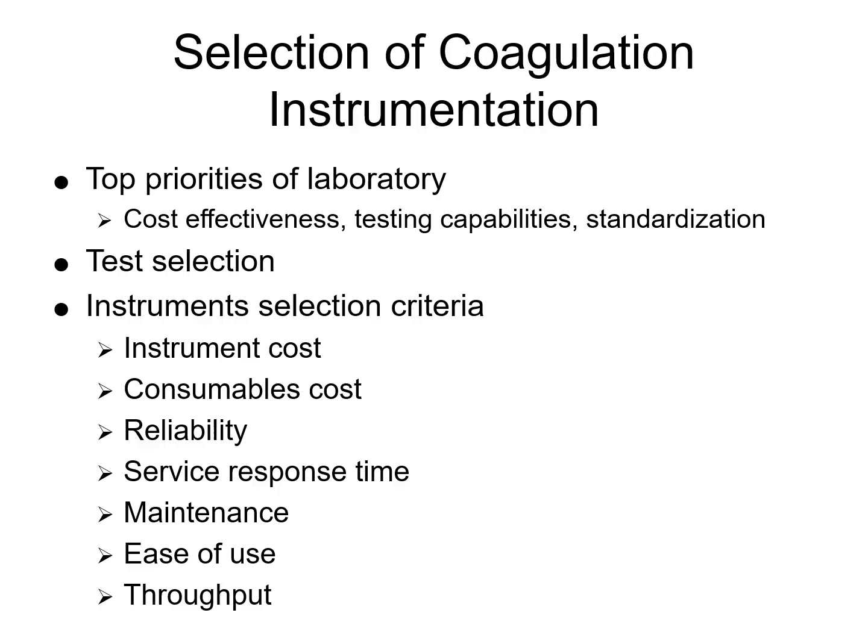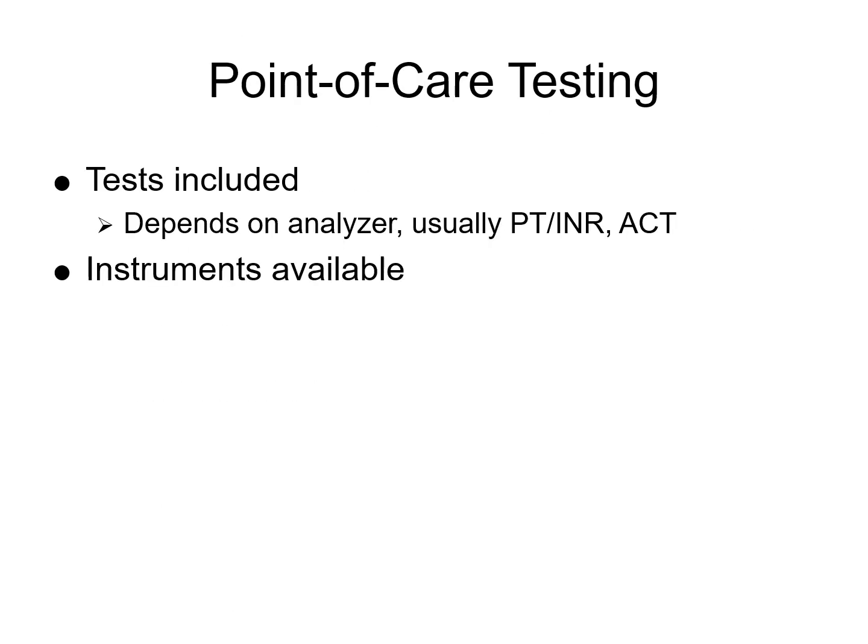Maintenance, so requirements for routine upkeep and ease of performing maintenance tasks. We want it to be easy to use. We want it to be user-friendly. We want it to have a good interface that people can use. We want good training and good workflow integration as well. We're also going to look at throughput. So we want to look at the number of tests that can be processed in a given time frame, matching the lab volume demands.